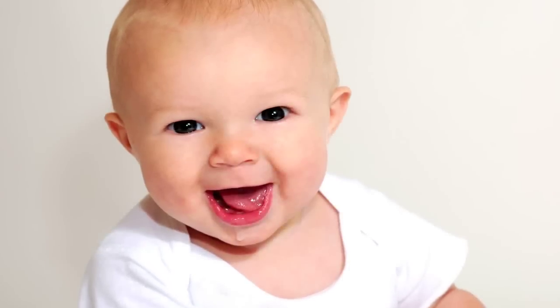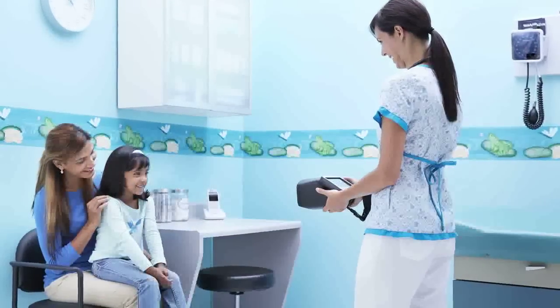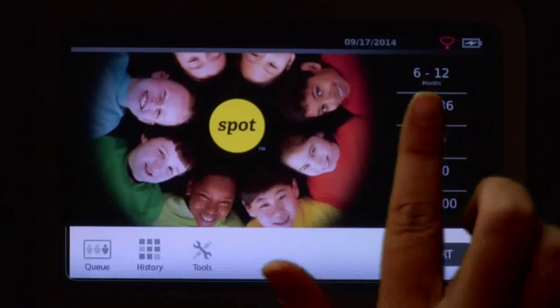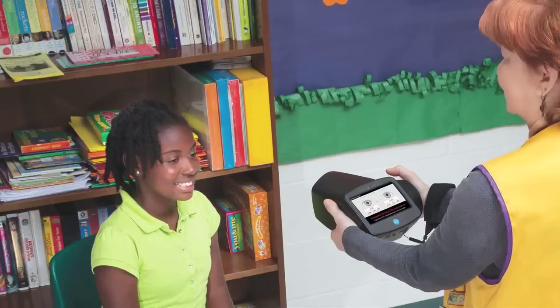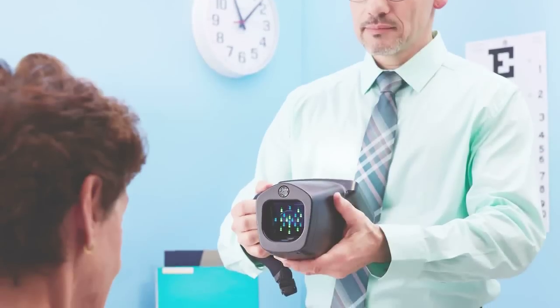Spot is a handheld portable device designed to help users quickly and easily detect vision issues in patients aged 6 months through adult, and patients with limited mobility or other limitations. Spot captures binocular screenings from a comfortable and non-invasive 3-foot distance. The modern touchscreen display allows for one-touch activation, simple management of patient data entry, and easy configuration for both vision screening and auto-refraction applications.